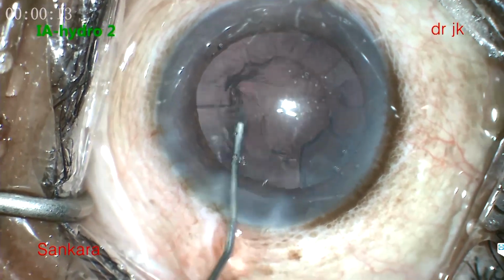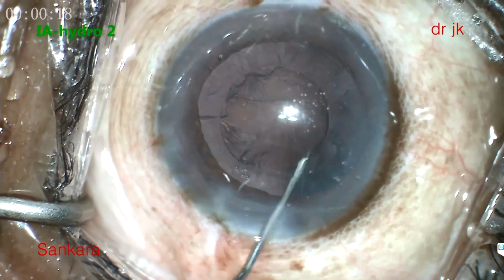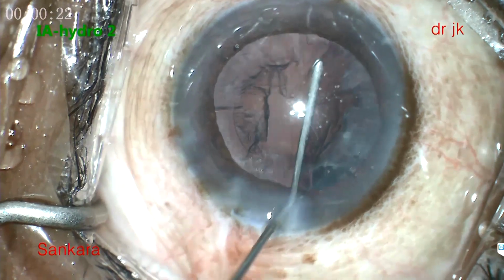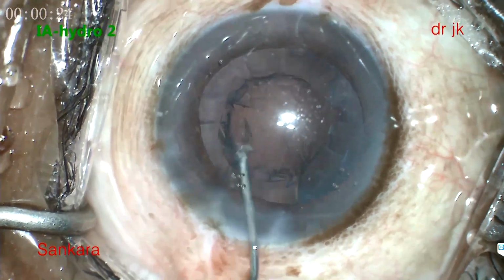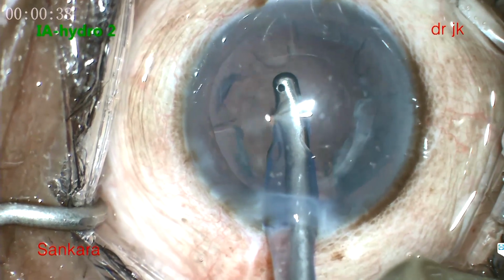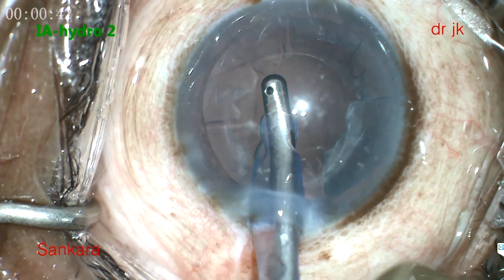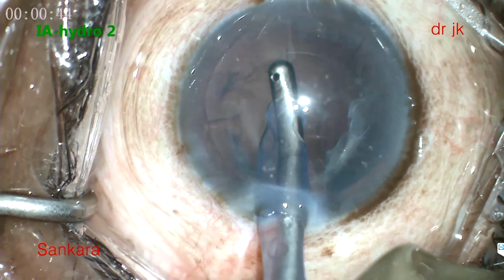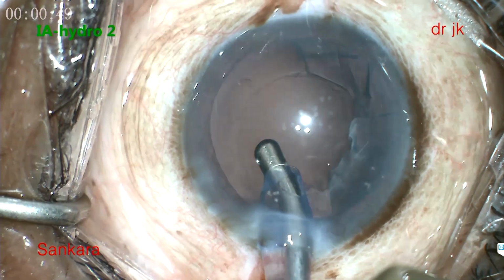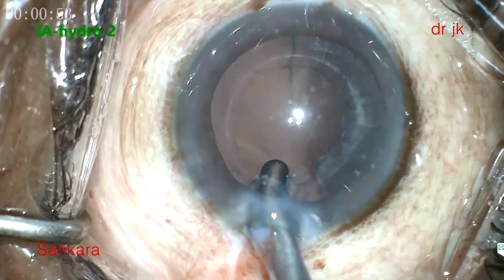Just do a small hydro separation before you go for aspiration. Separate it like hydrodissection, from the posterior capsule, because taking the tip close to the posterior capsule is a little bit risky. Once it's separated, the main trick is to keep the tip opening at an angle. Don't keep it facing down; keep it facing above toward the anterior capsule, or a little bit with an angle, that's all. Don't go down like that. Then again turn it and take it.